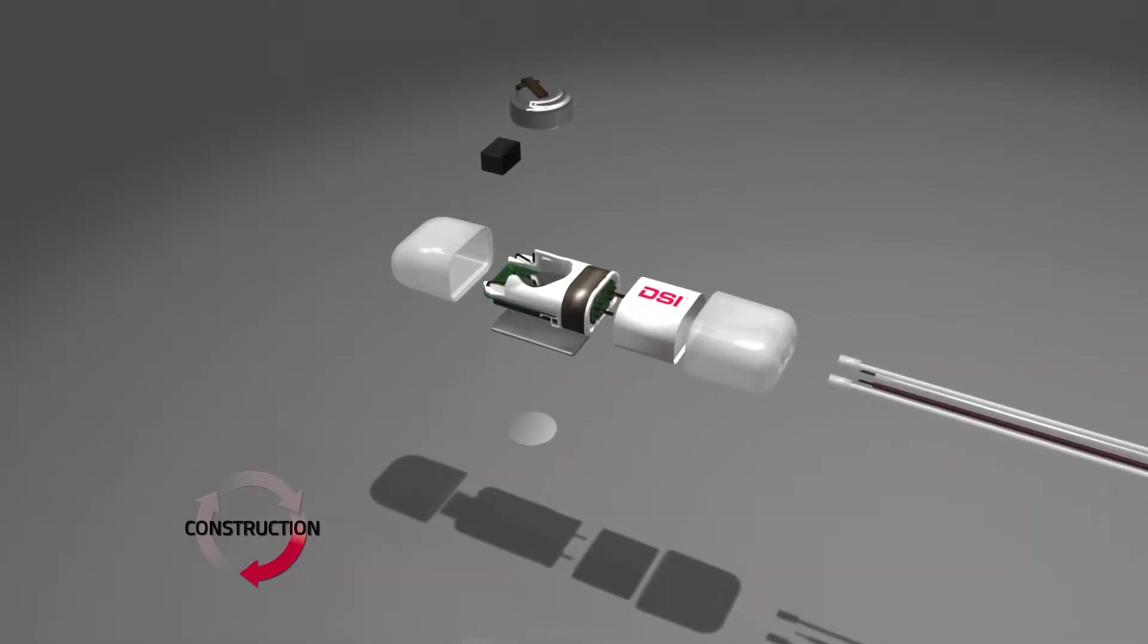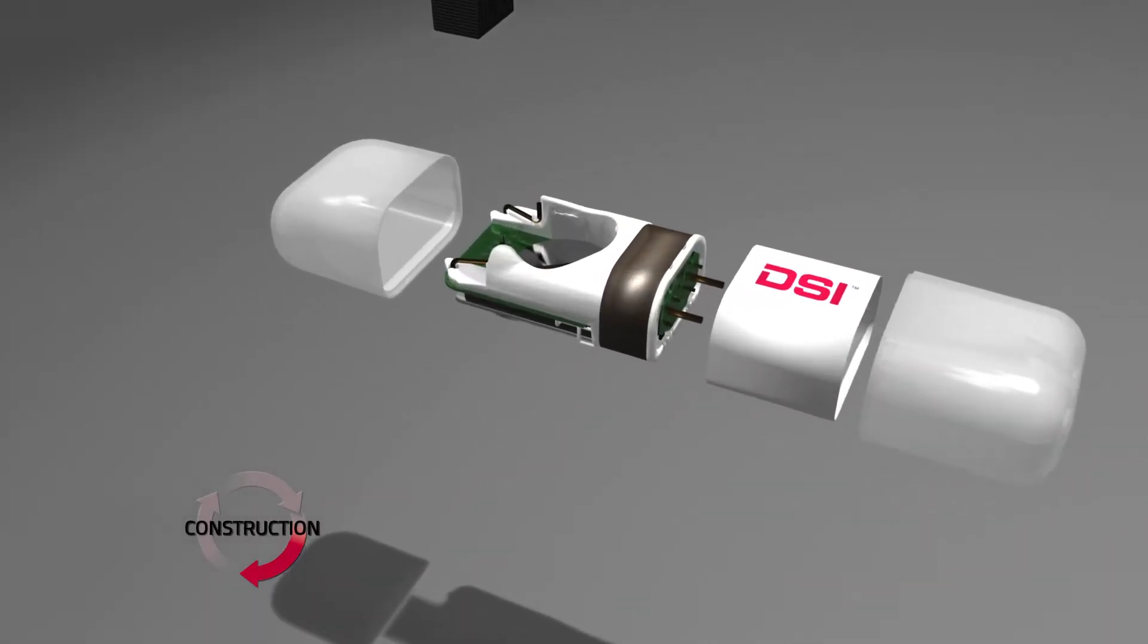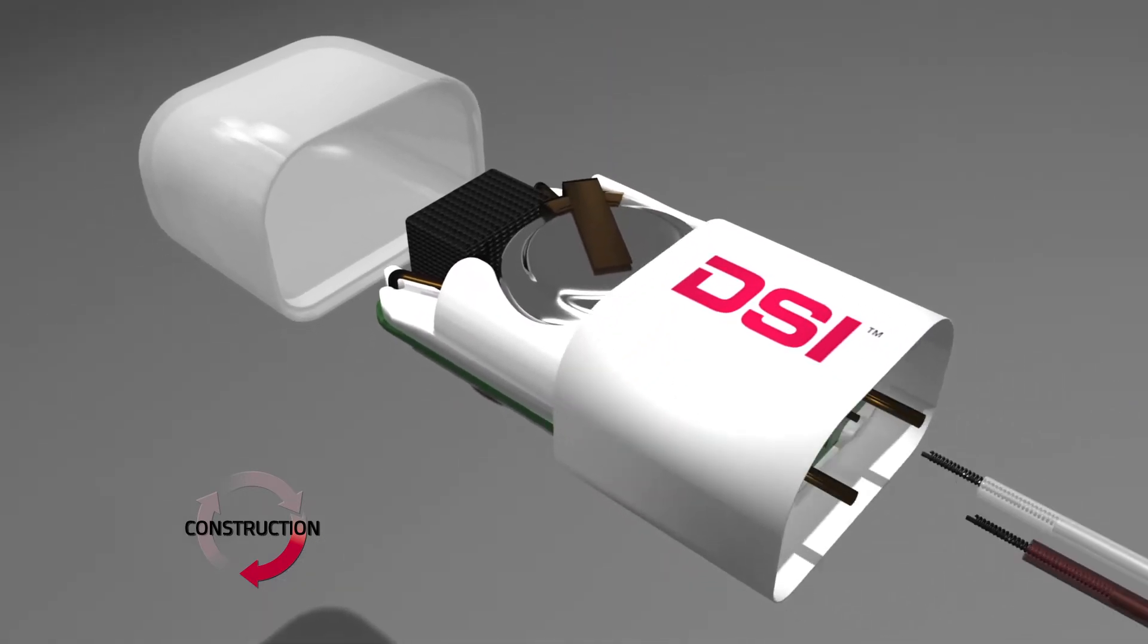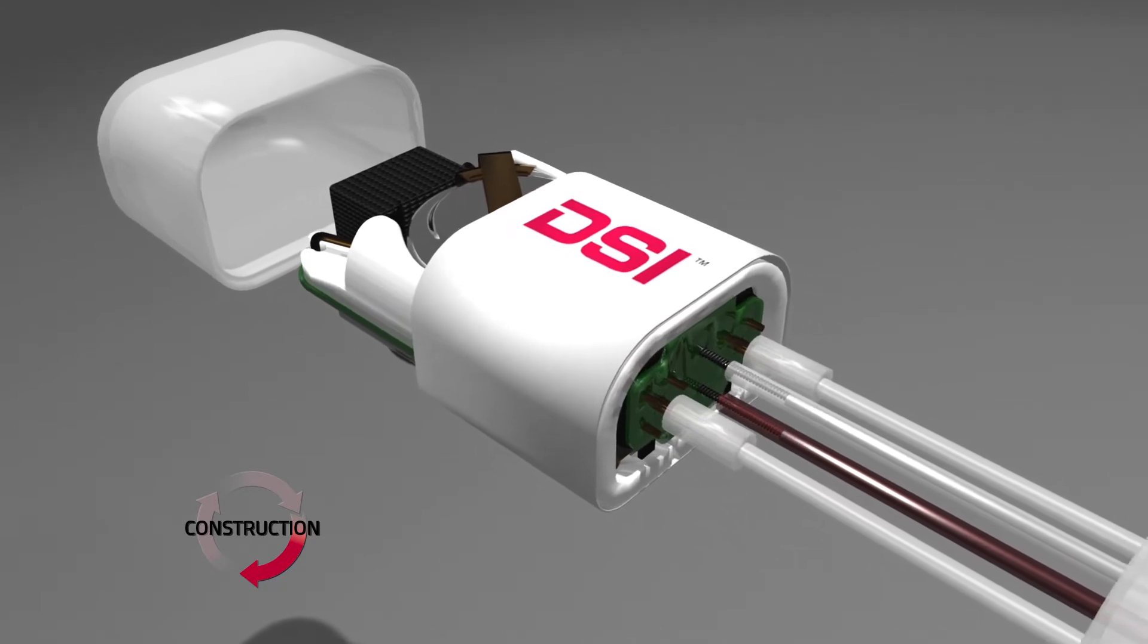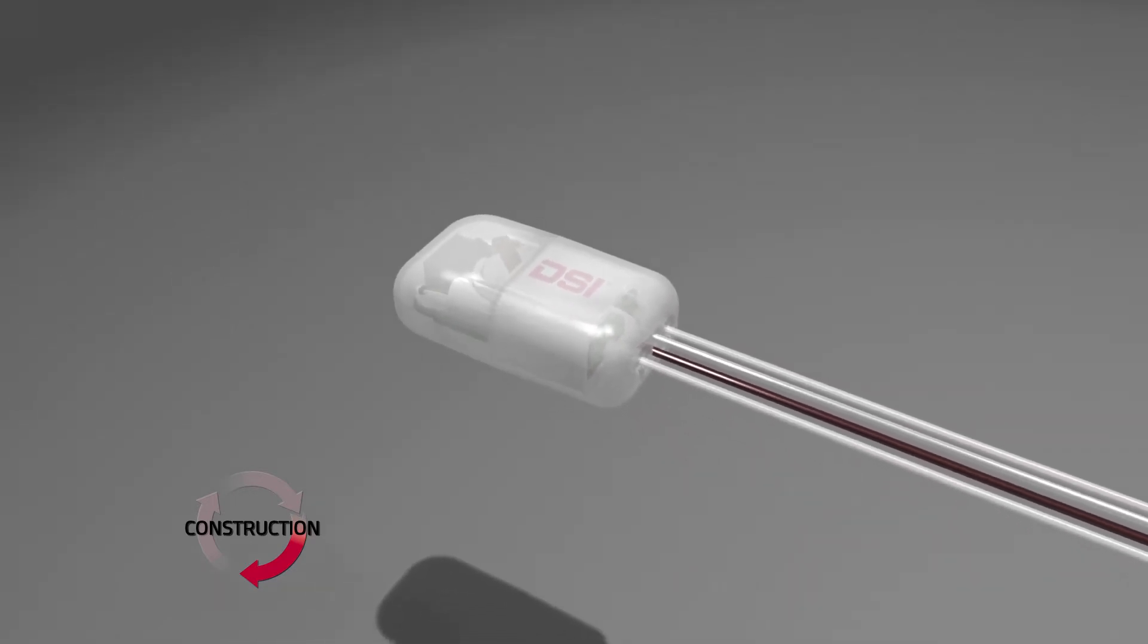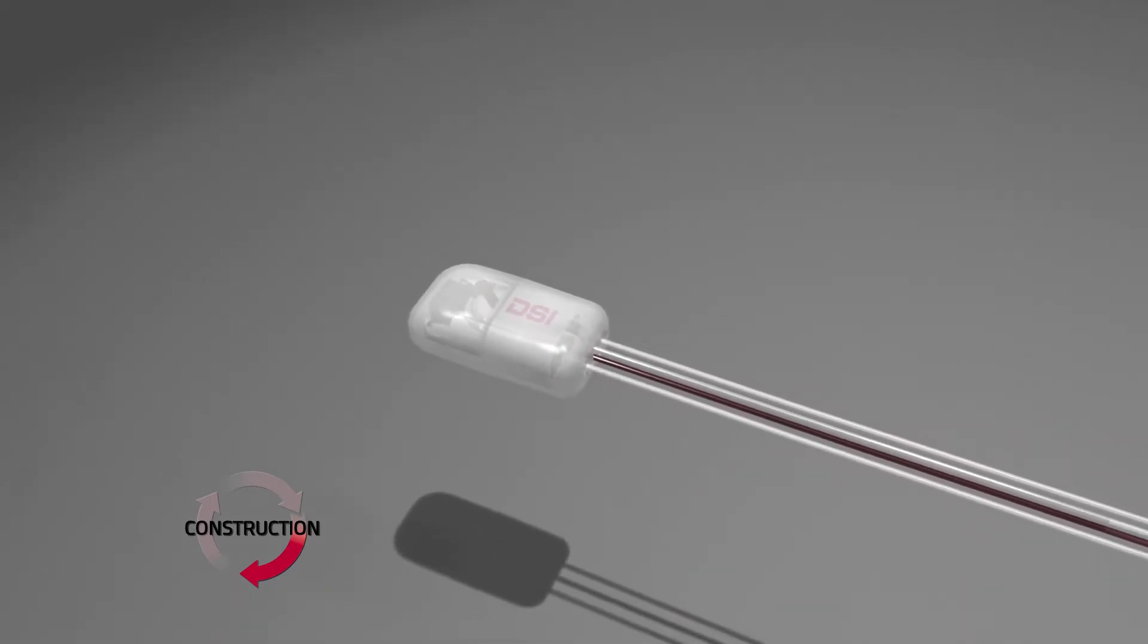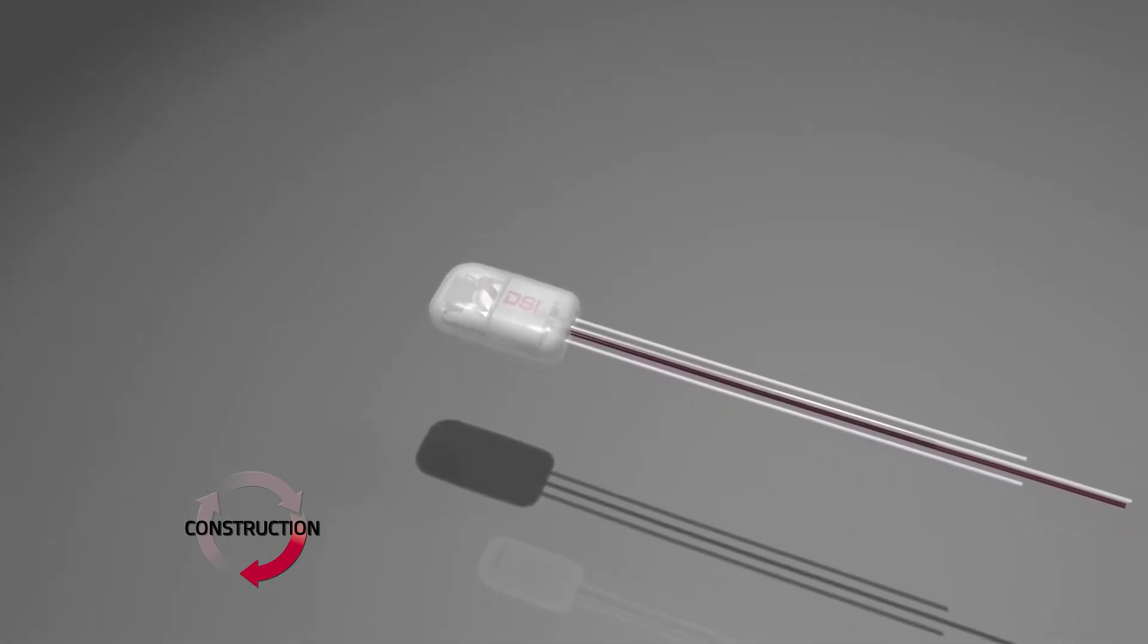Each implant is hand assembled by DSI's highly skilled technicians. A new battery, biopotential leads and catheter are installed and several steps are taken to ensure that a biocompatible device, guaranteed to perform to specification over the warranty period, is delivered.